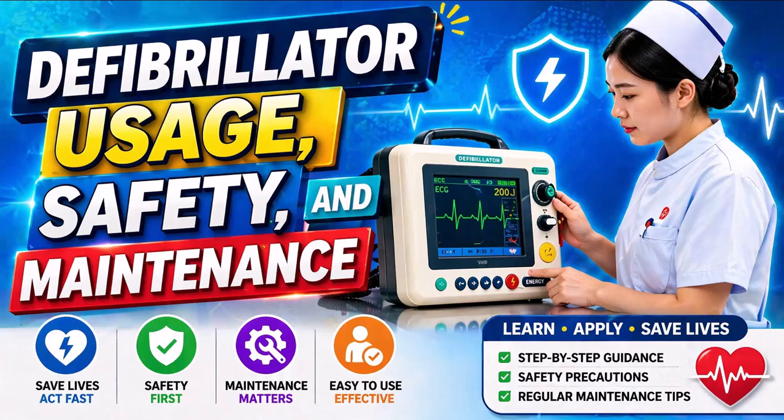Another type is the automated external defibrillator, or AED, which is designed for use by non-medical personnel. AEDs analyze the heart rhythm automatically and guide the user with voice instructions. More advanced devices include implantable cardioverter defibrillators, or ICDs, which are surgically placed inside the patient's body. However, in this session, our focus will be on external defibrillators commonly handled and maintained by electromedical technicians.